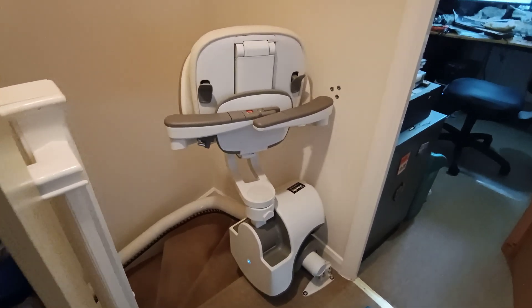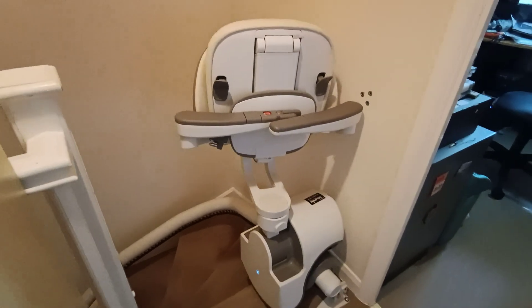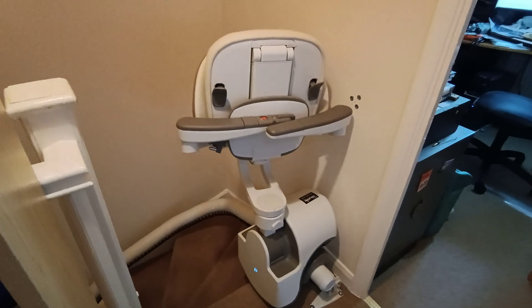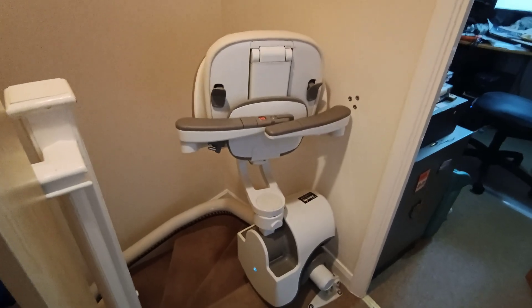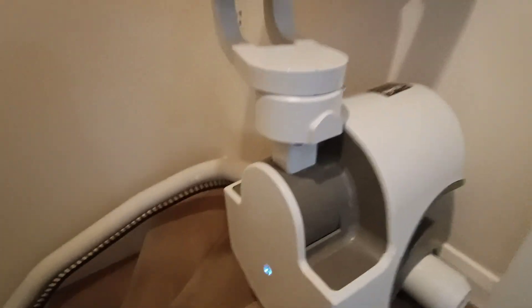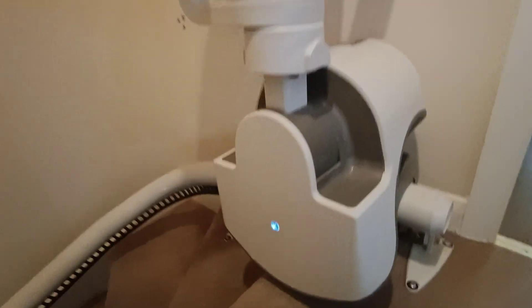So we were having trouble with the stairlift getting stuck part way up - it would beep and flash lights. We couldn't figure out what to do, and you can't get hold of maintenance manuals or anything like that it seems. So I'm just going to take you through some quick things I've learnt.